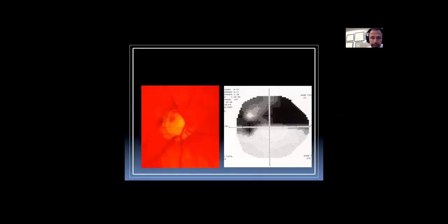And of course, one of the most common conditions that causes visual field defects that respect the horizontal midline is glaucoma. In this patient with the obvious notching inferiorly and loss of nerve fiber layer, you expect to see a superior field defect that respects the horizontal midline. There's a little extra hint of glaucoma over here with this partially resolving Drance hemorrhage. So glaucoma, as I like to kid my glaucoma specialist friends, is just a small subset of neuro-ophthalmology, just another form of optic neuropathy.